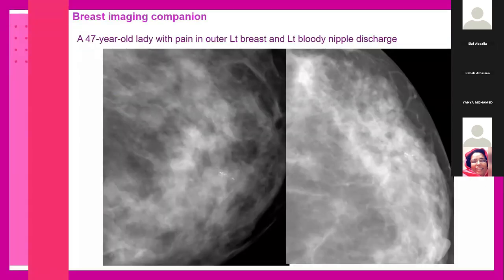This 47-year-old lady presented with pain.